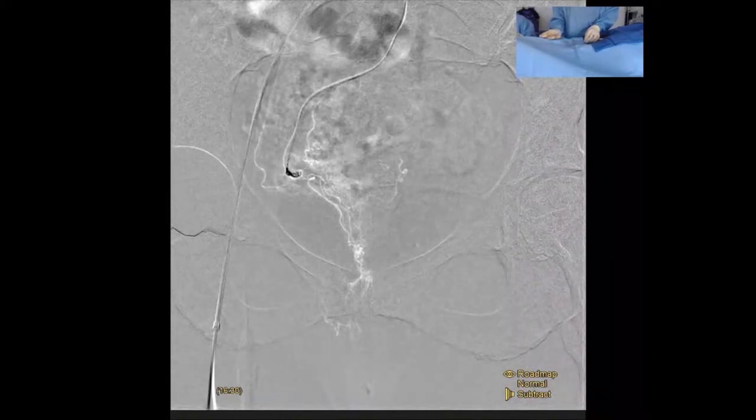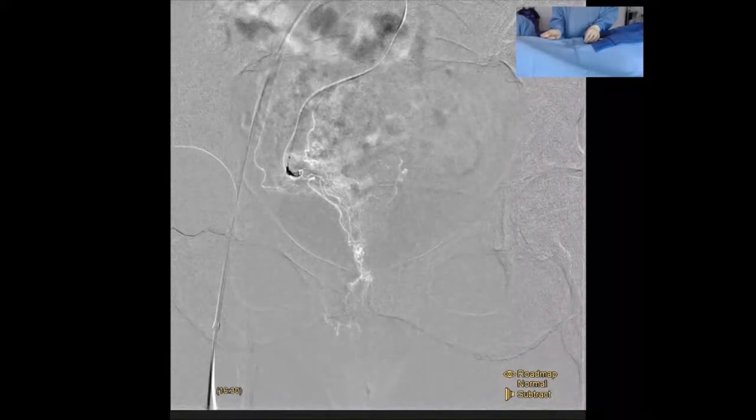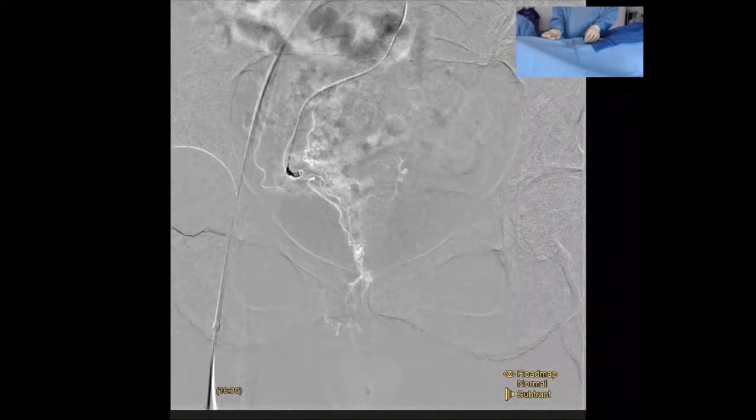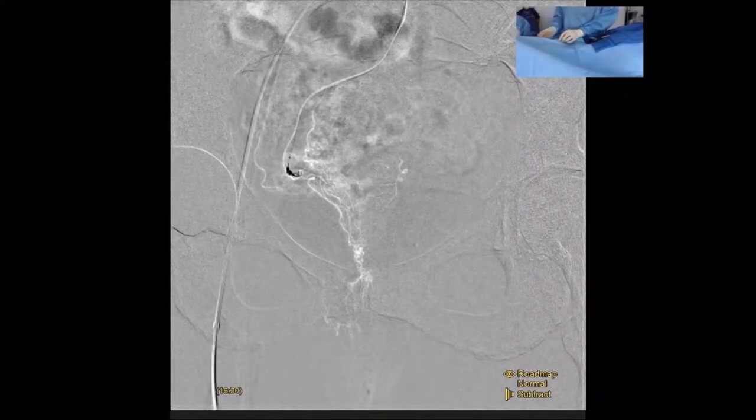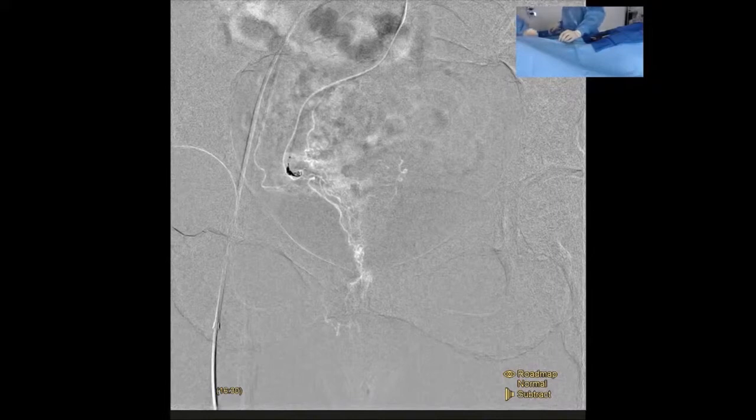So you can see the retractor. I'll just move it back and forth. You can see that little dark spot is the retraction portion of the coil. It's coming back, and that's going to come out. Let's take one more maybe. We'll use a 3 here. We'll back this up with a 3.